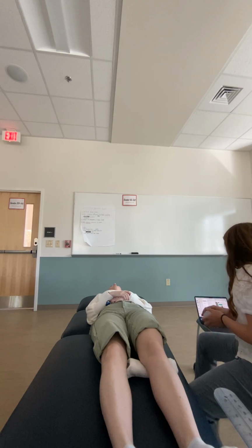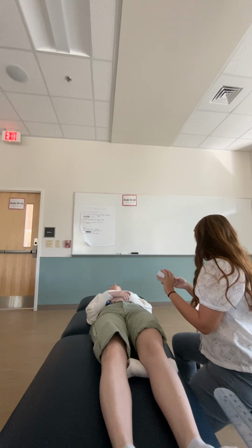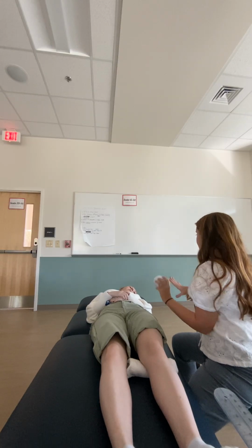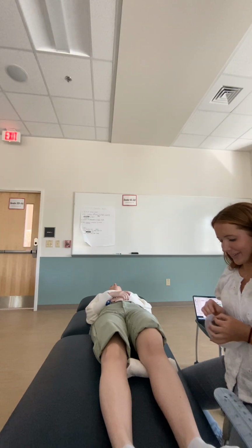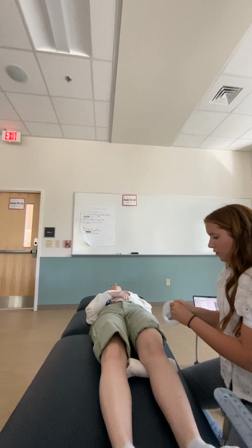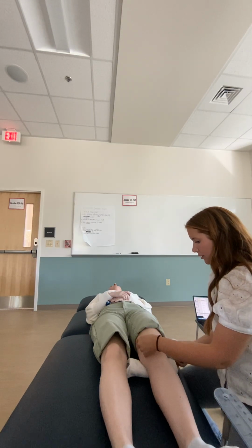And then the first thing we do is we're gonna put some of this tape. This is gonna be the only thing touching your skin. Okay. It's just gonna sit relaxed on there, okay? It shouldn't feel weird. So let me know if it does. Okay. So with this, we're gonna go a little bit longer than the length of your kneecap.